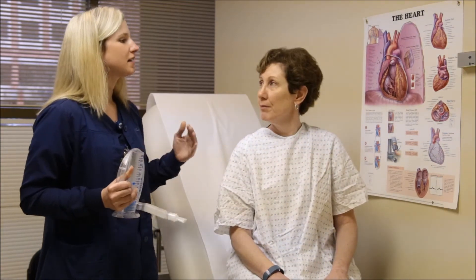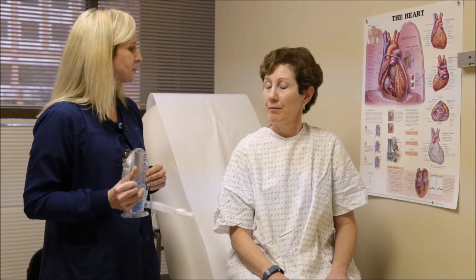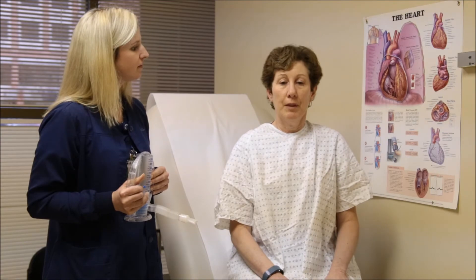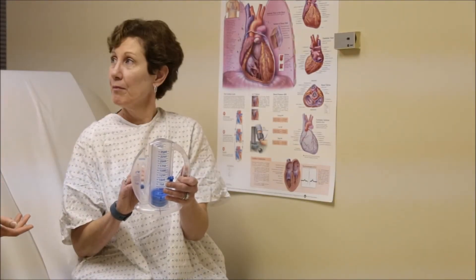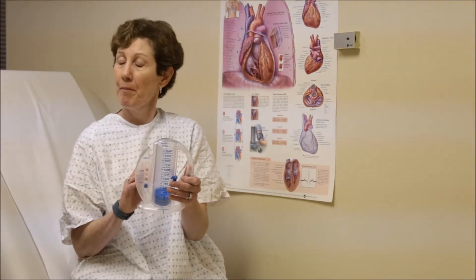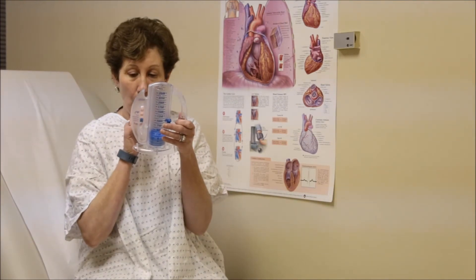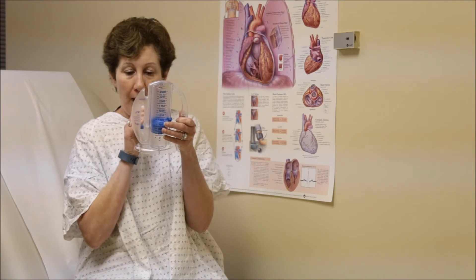Okay, and now take a nice deep breath in and hold for maybe a few seconds before you exhale. Great. Take that sigh like I said before to empty out your lungs. Great. Now take a nice deep breath in and hold for a few seconds. Great job.